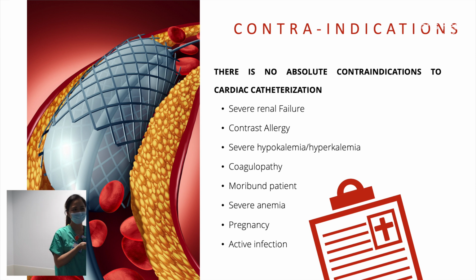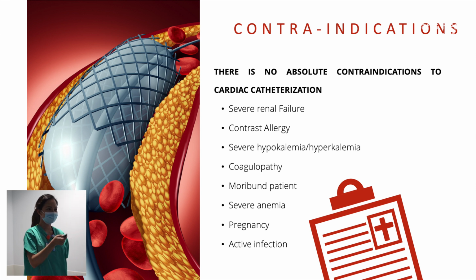Pregnancy. There are a lot of things going on for this one. First one is the contrast medium, and next one is the X-ray. Again, this should be discussed prior to doing the procedure. Make sure to weigh the benefits and the risks. But I think for the X-rays, they have a special lead to cover the belly. But I don't think there is, we don't really use it here.